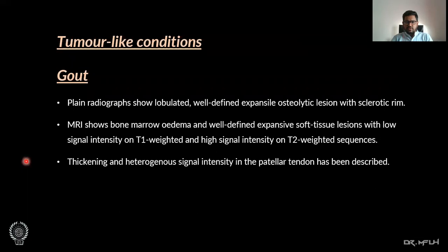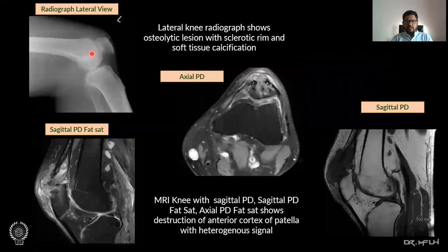Tumour-like conditions include gout. Plain radiograph shows a lobulated, well-defined expansive osteolytic lesion with a sclerotic rim. MRI shows bone marrow edema and a well-defined expansive soft tissue lesion with low signal intensity on T1-weighted and high signal intensity on T2-weighted sequences. Thickening and heterogeneous signal intensity in the patella tendon has been described. Here we can see a lateral knee radiograph showing an osteolytic lesion with sclerotic rim and soft tissue calcification.